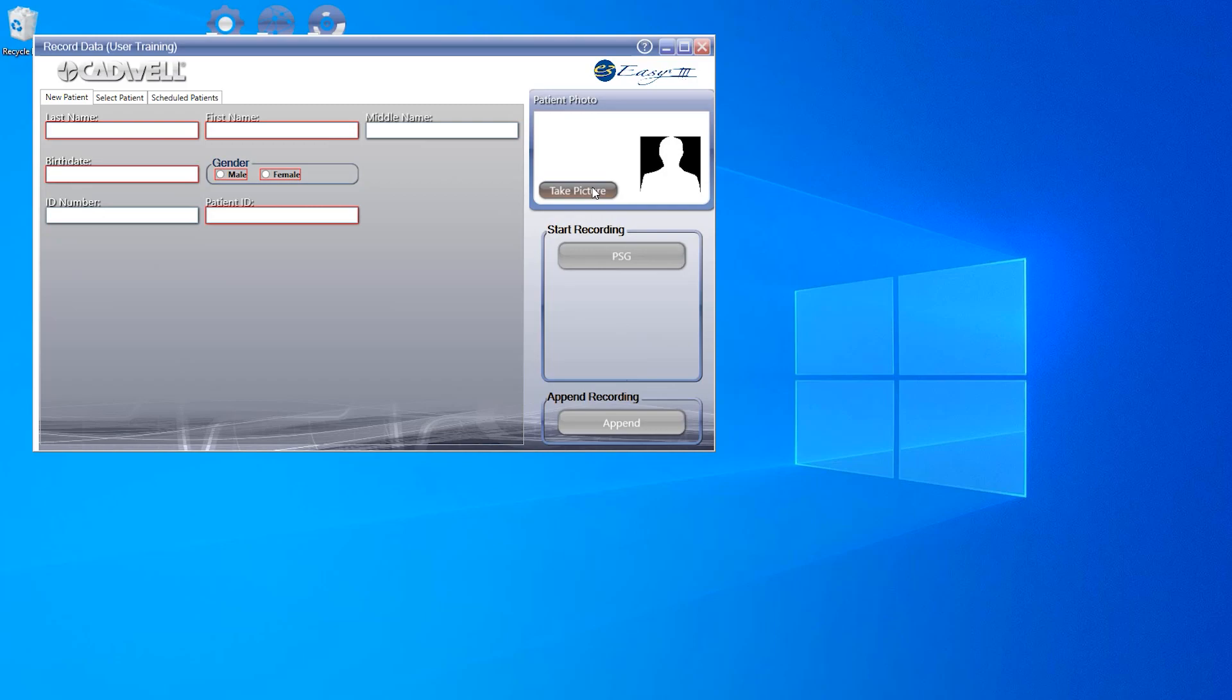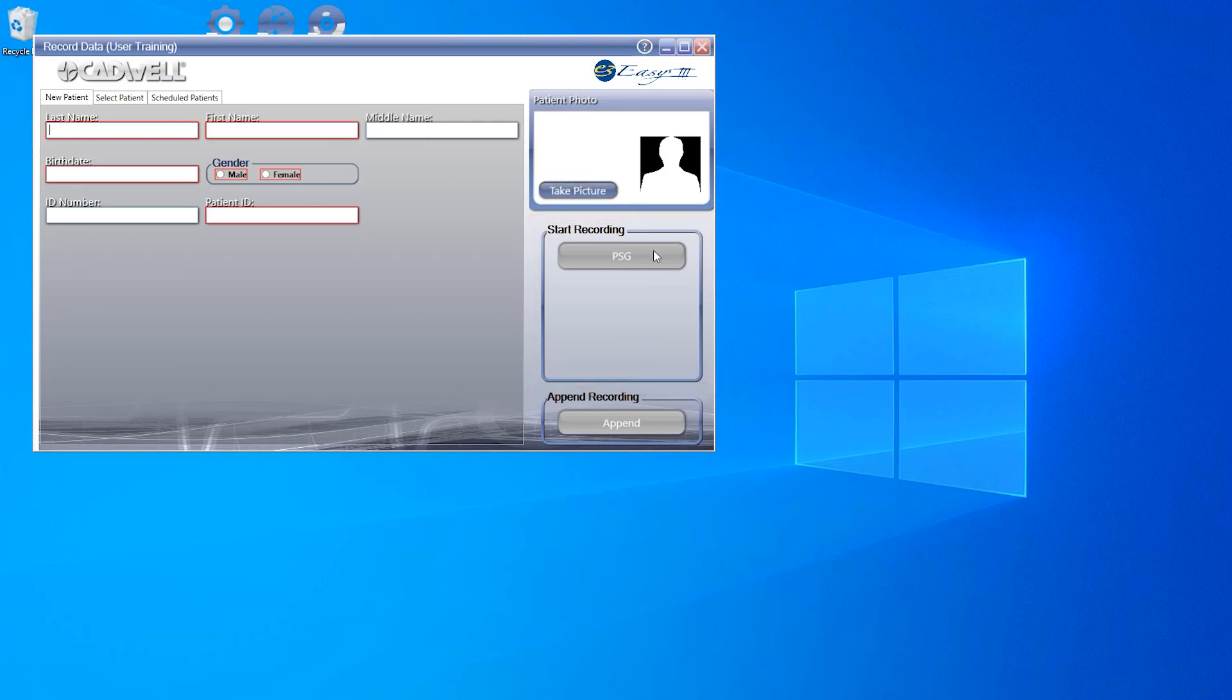Please keep in mind you will need to have a camera integrated into your EZ3 system for this feature to work. You may have buttons that will allow you to select the type of test you will be recording in the Start Recording area. For the purpose of this video, we will be using the PSG button.